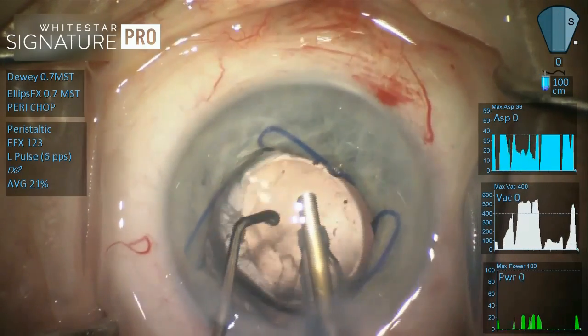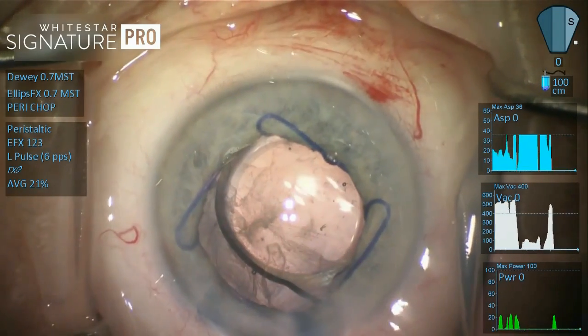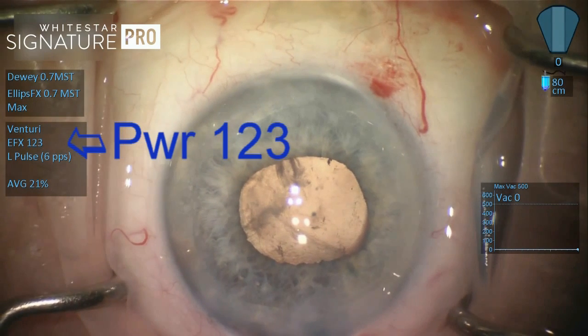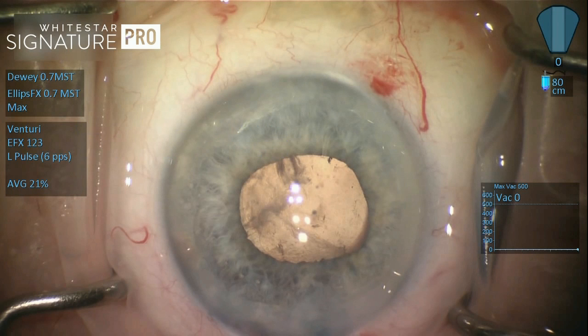Now, of course, she had edema, but not much considering how long this case was, which in hindsight was 15 minutes. But the amount of power we used was only 123 EFX, which is probably 1/3 of what it would have been with the previous incarnations of this machine. So this lovely 93-year-old, a true champion, a true survivor, is back living in her cabin in remote Colorado. I was delighted to have the chance to help her.